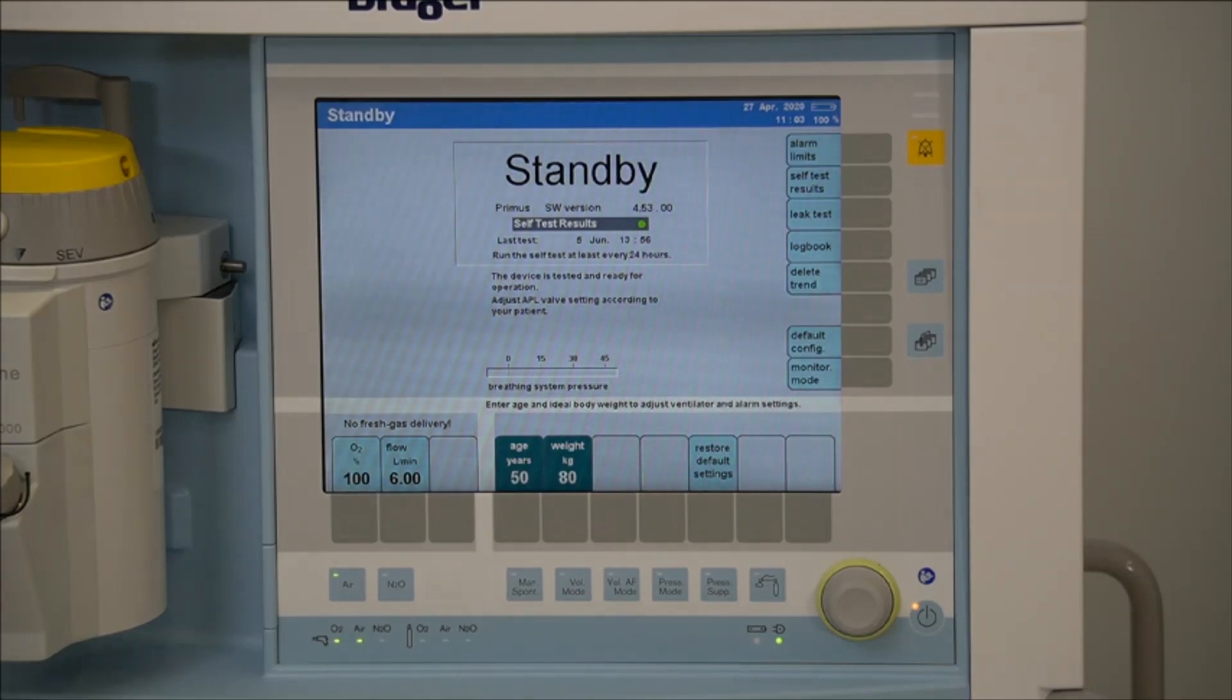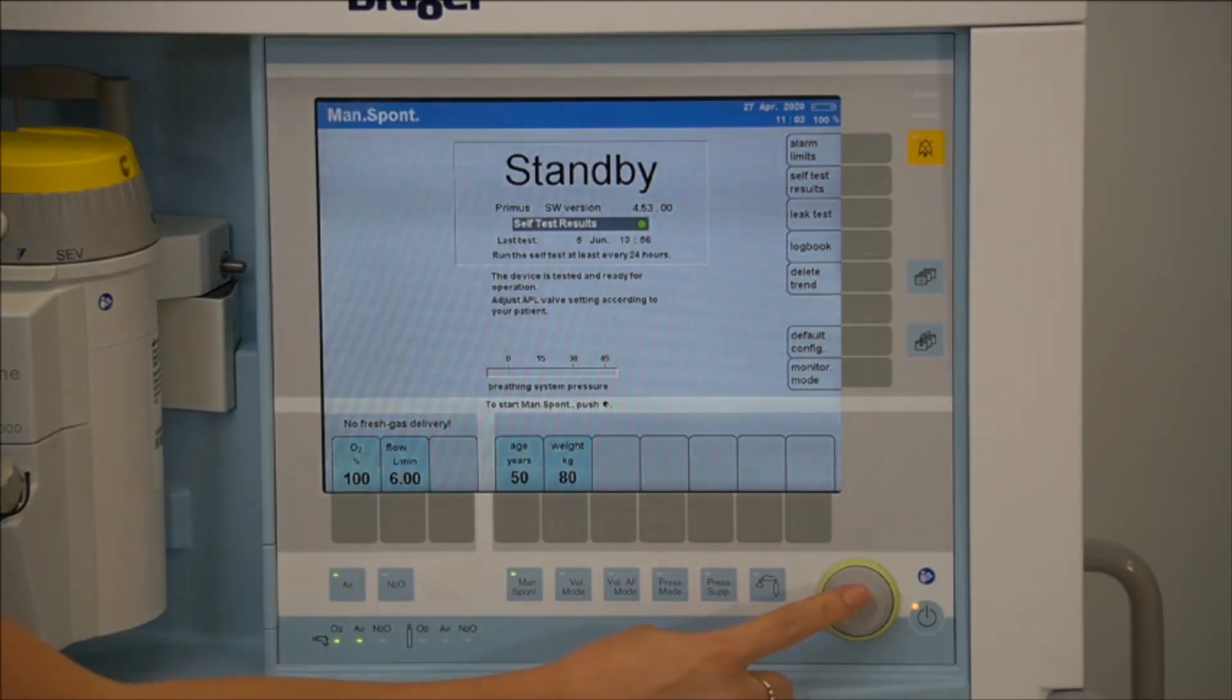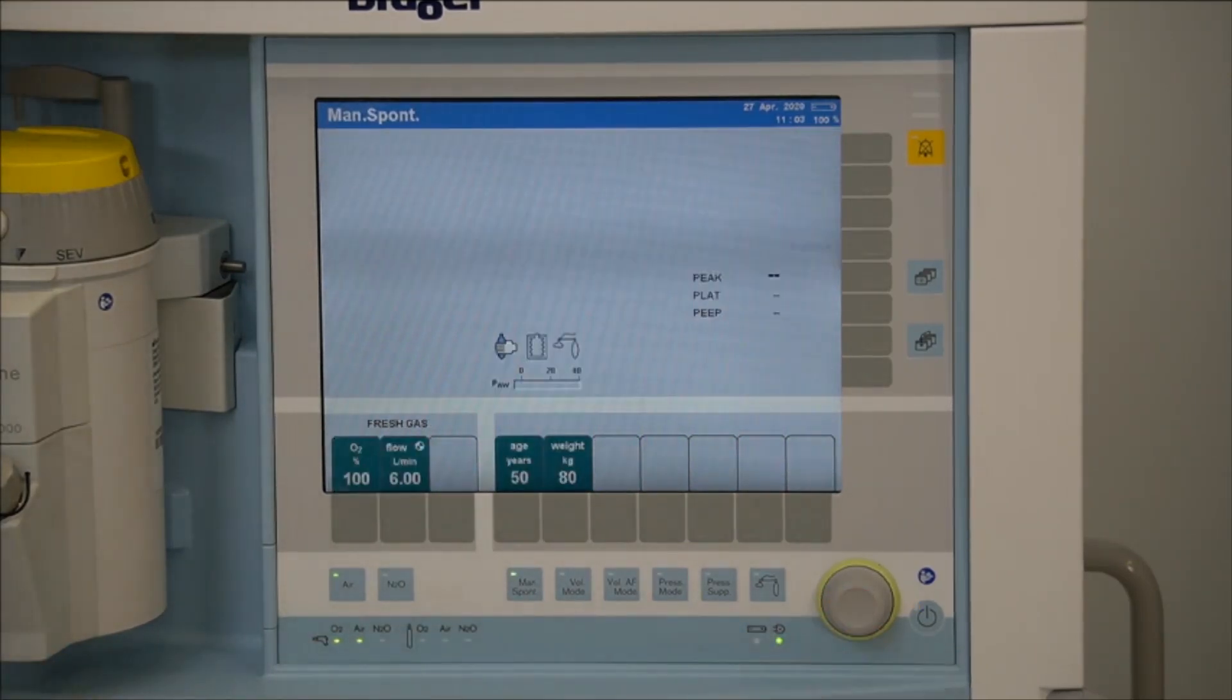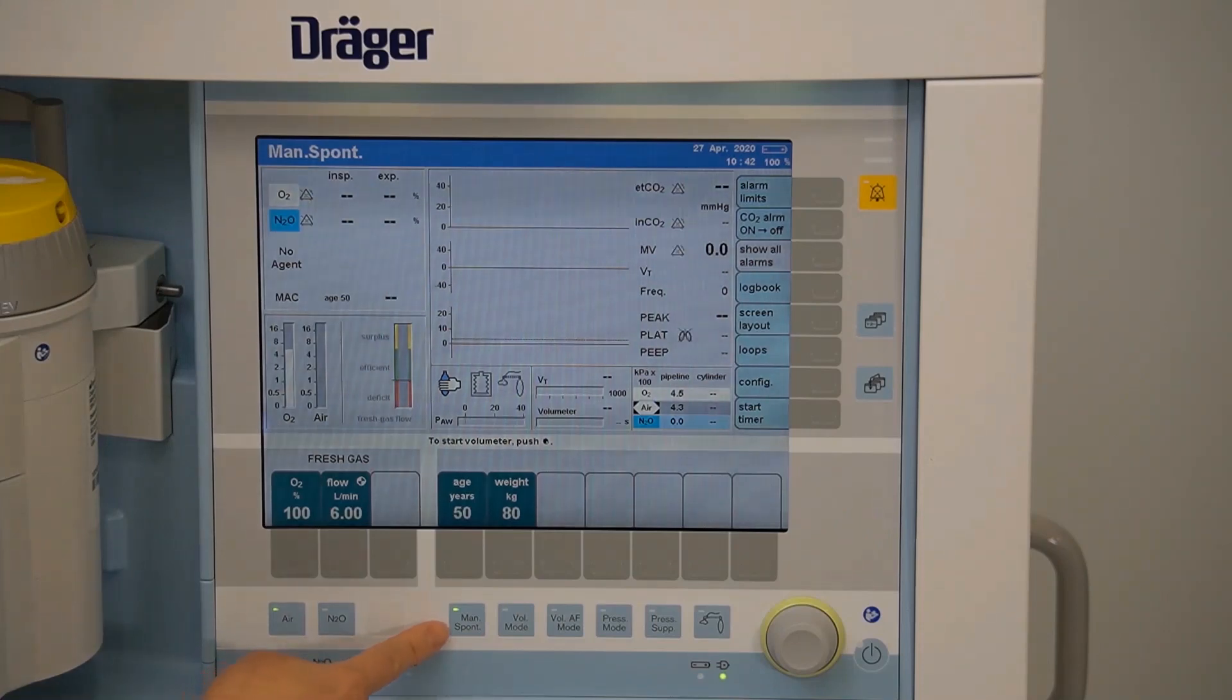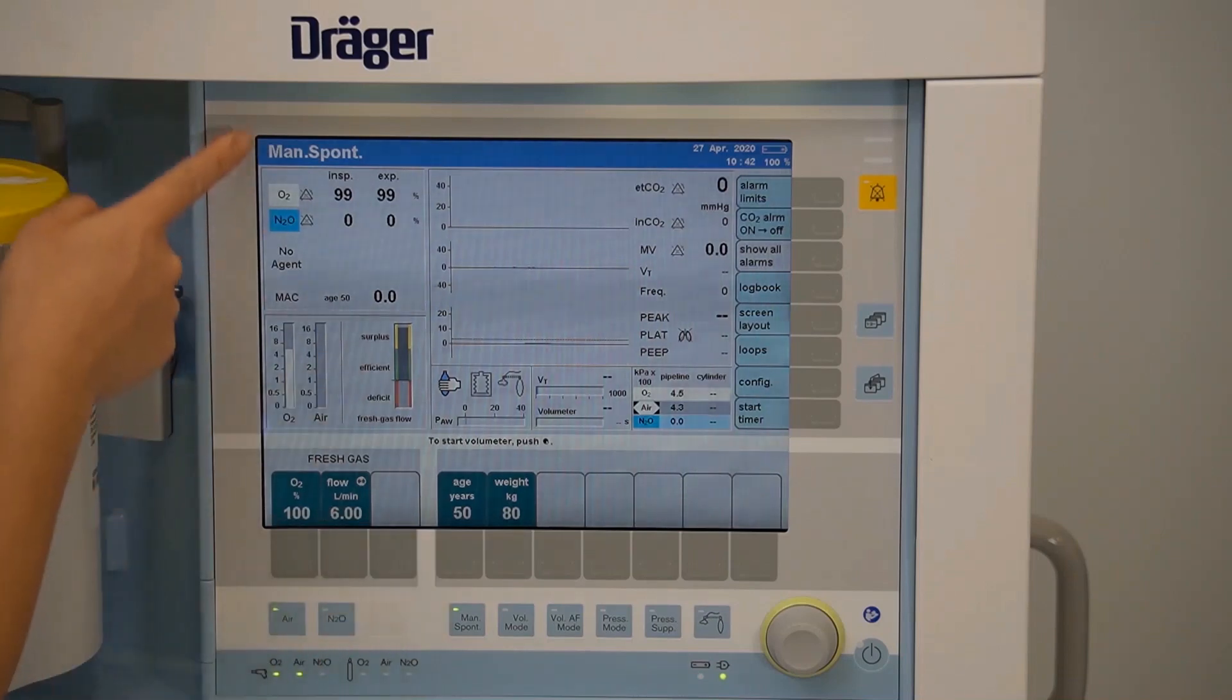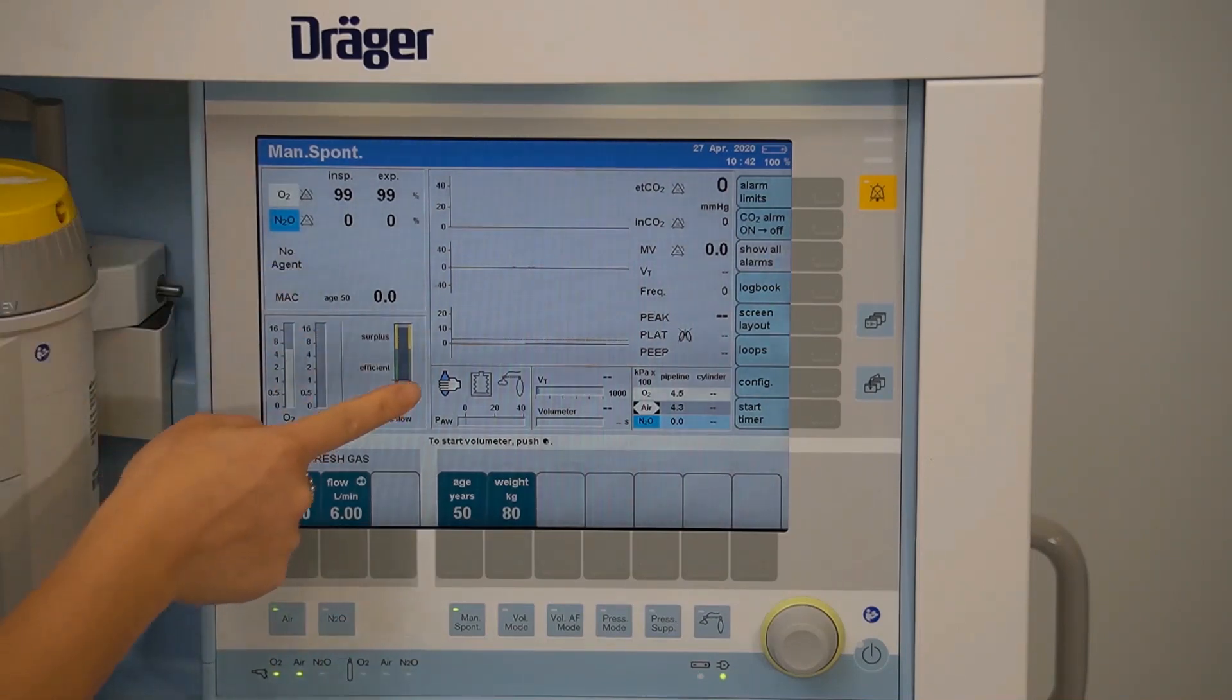Generally you'll start with manual spontaneous mode, select your mode and confirm with the rotary knob. Your current mode is highlighted with the LED light indicator, is stated at the top of the screen, and also highlighted with this graphic.